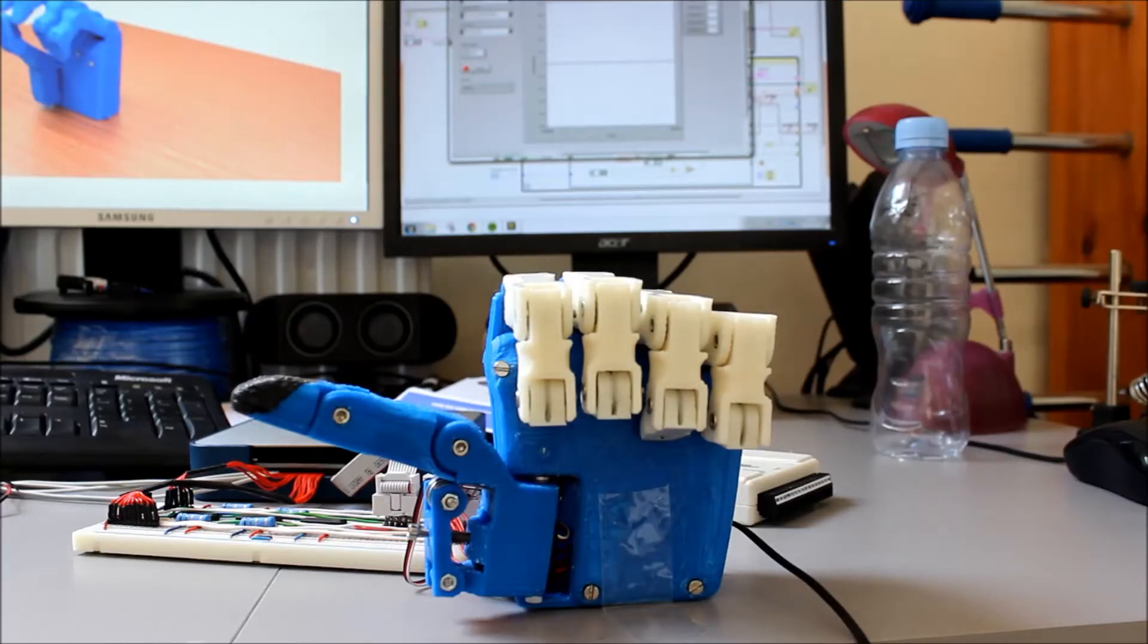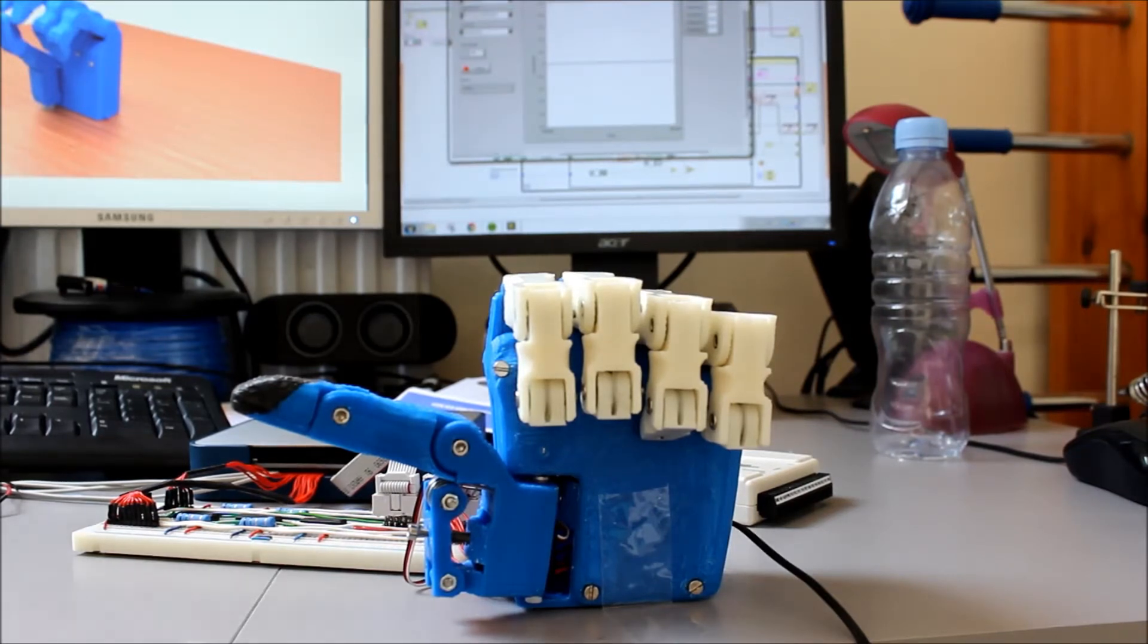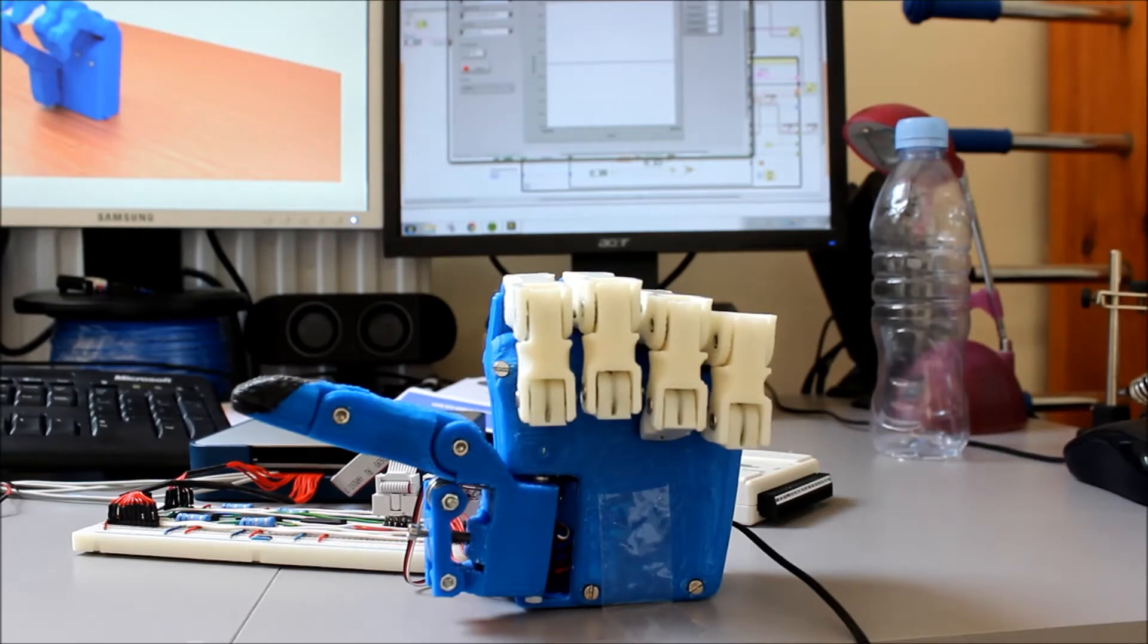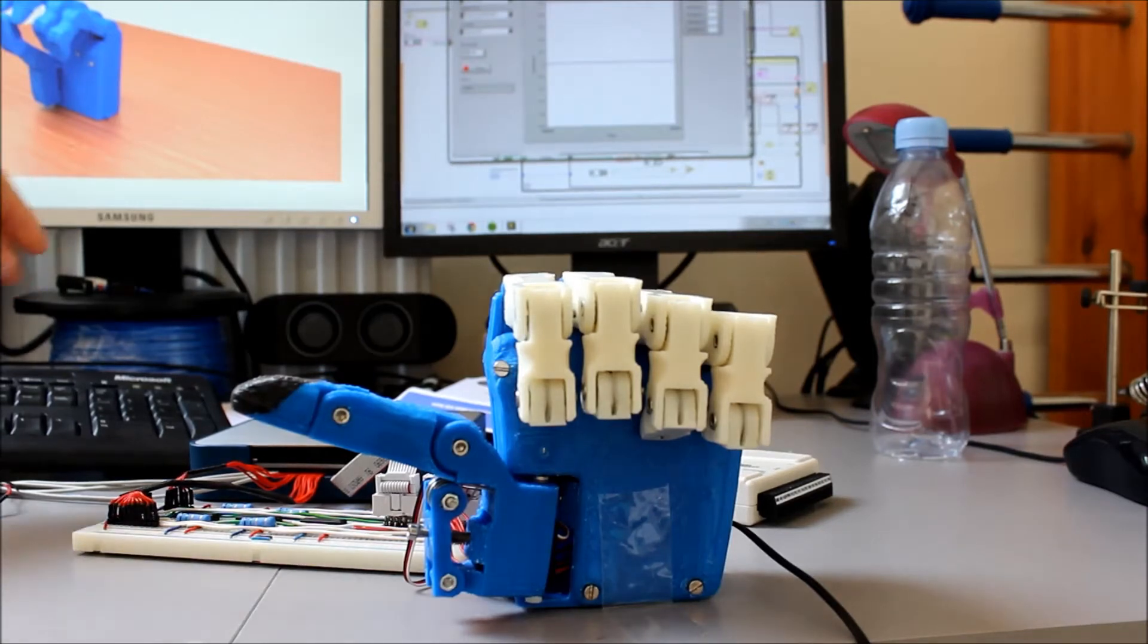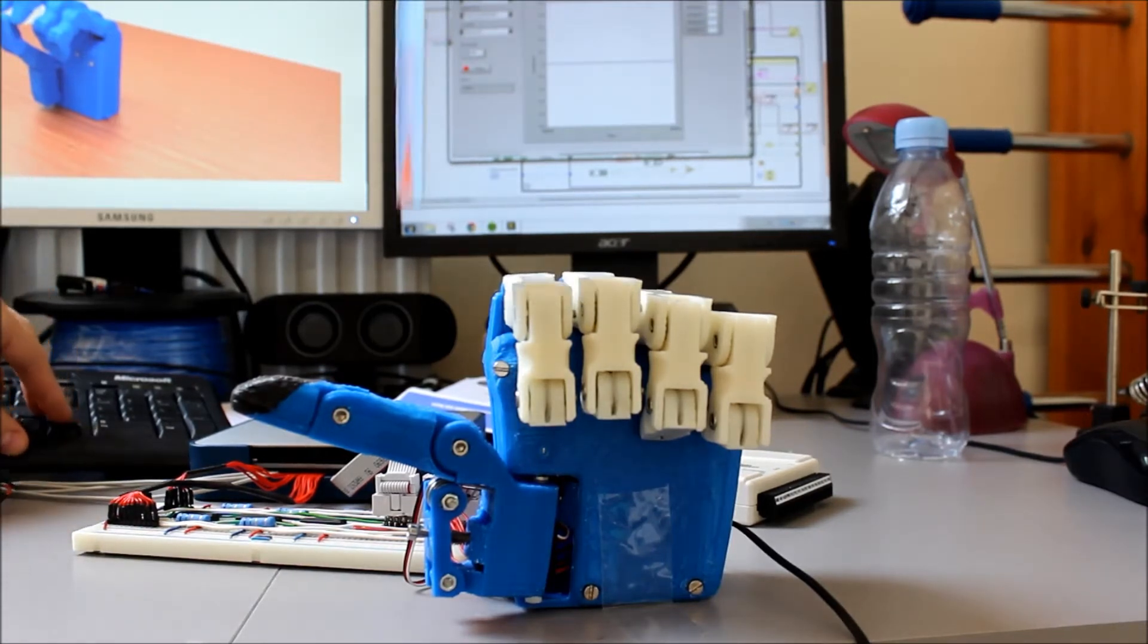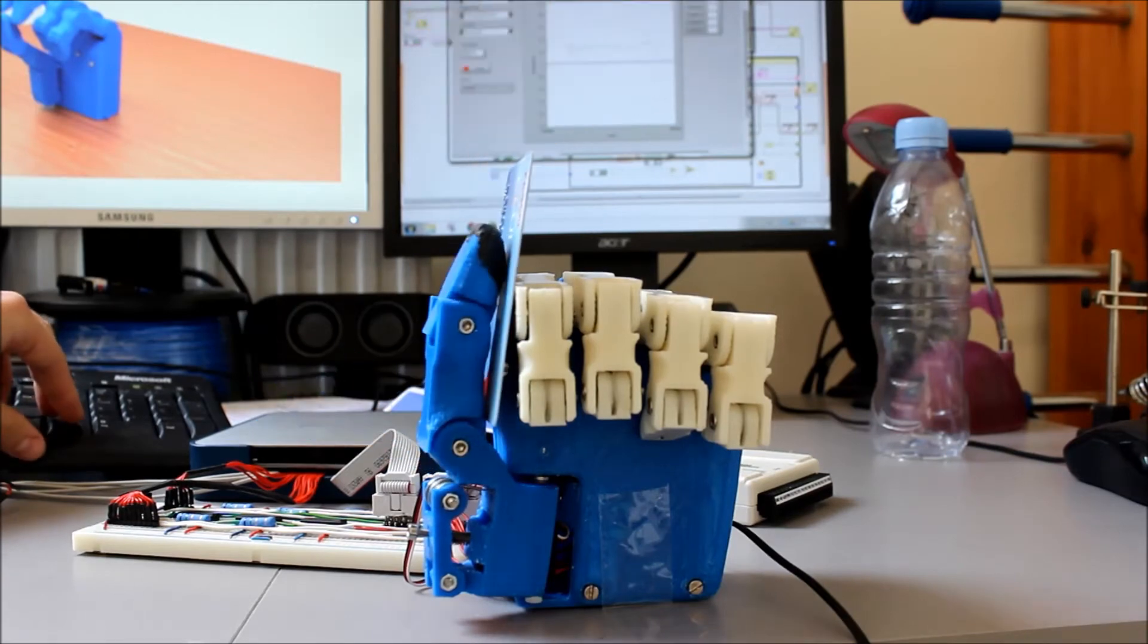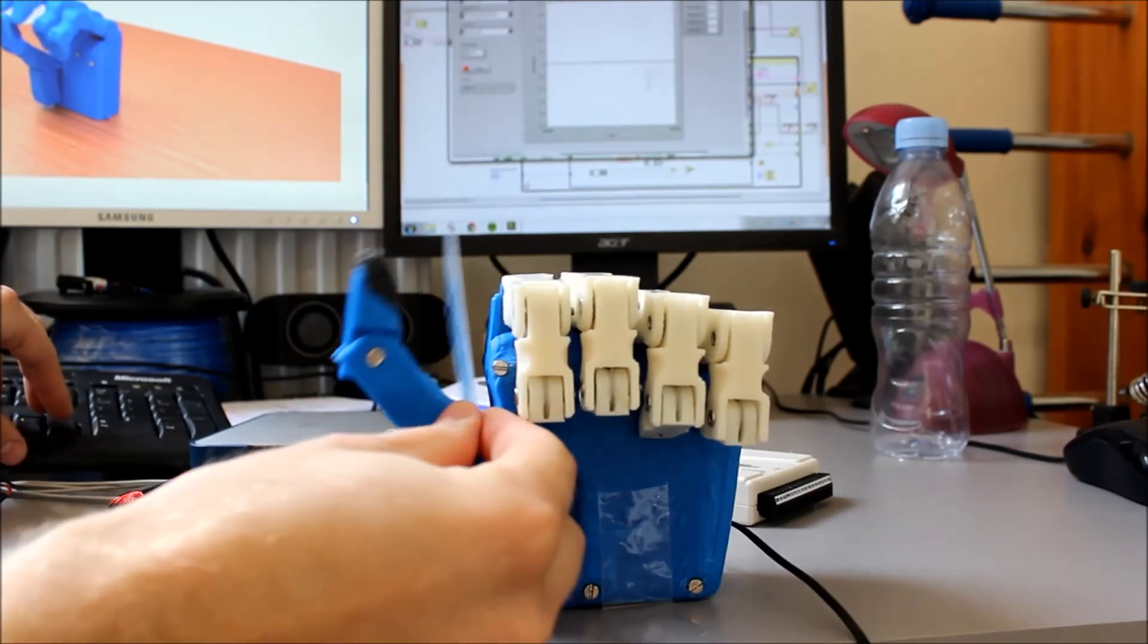So here we have the key grip pattern. And here we can grasp all sorts of things. So maybe a credit card for instance. I'm not going to get my credit card out because then you'll all steal my money. But a Tesco club card for instance, it can grab very easily like this.